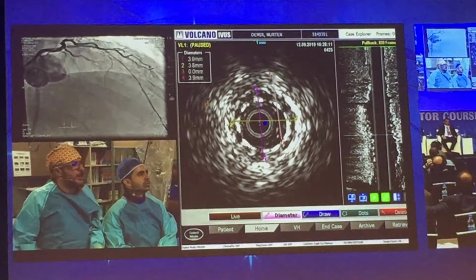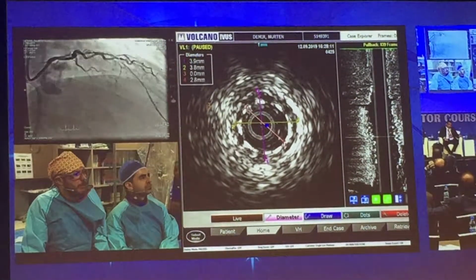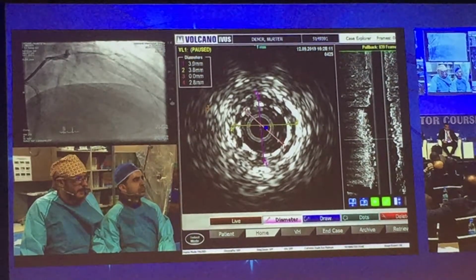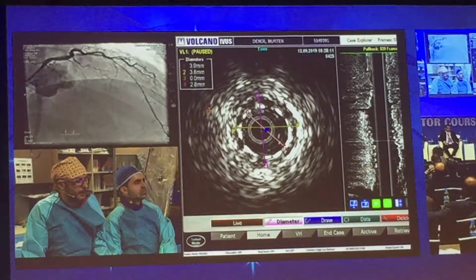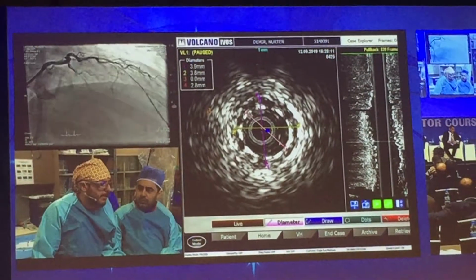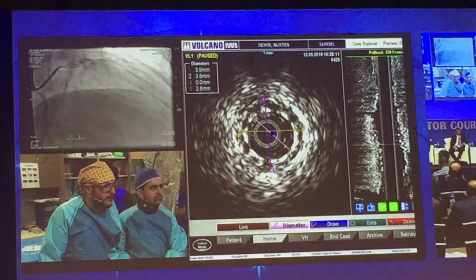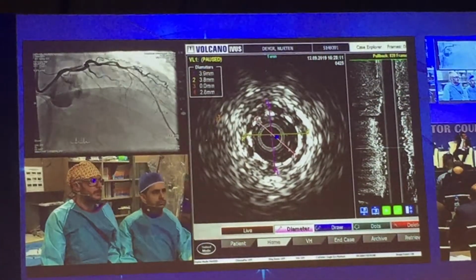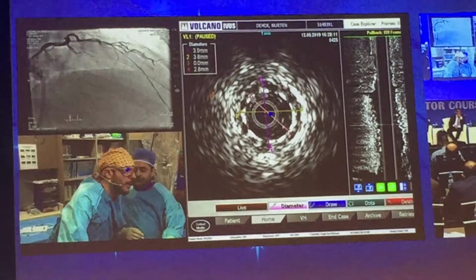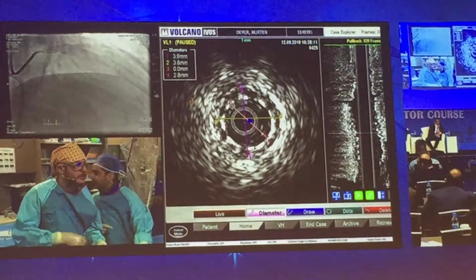Do you have any recommendation regarding after the total occlusion we have also a long lesion there? Should we just try to do first ballooning? There is a lesion starting from the diagonal bifurcation and extending to the distal segment of this vessel. I think the diagonal branch is fine, and we know that this was also seen in the retrograde shots in the very beginning of the procedure. And you can expand your stent till the diagonal branch, and at 3.5 or 3, or starting with a 3.5 will be sufficient, and you can finalize this with a 4.0 proximal optimization, and you can further treat the distal lesion with balloon inflations, because it looks like a spasm or something like that. Maybe it will heal in the future, and nitro will work, I think.